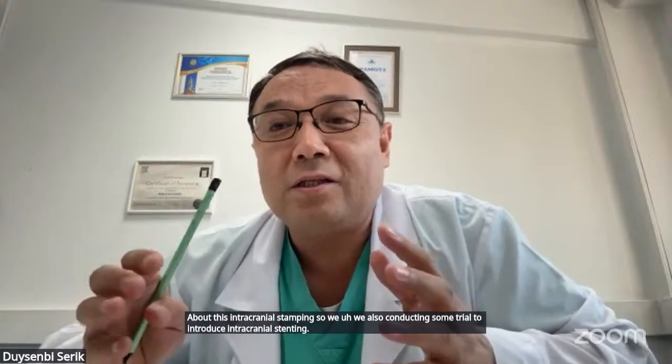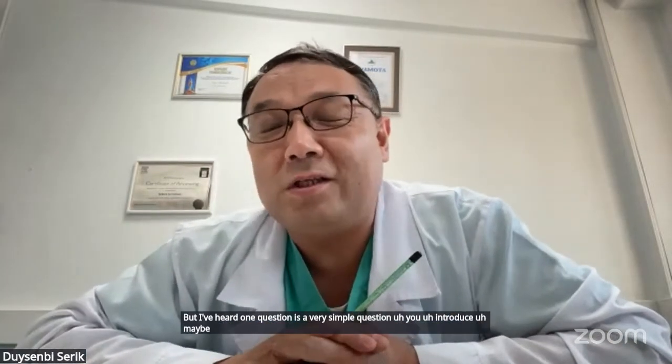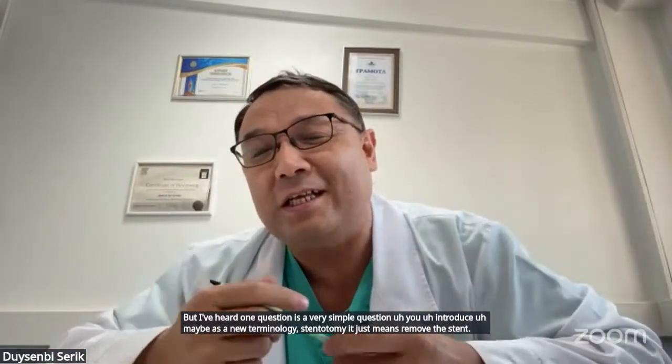But I have one very simple question. You introduced maybe a new terminology, stentotomy. It just means removing the stent using a Solitaire stent, if I understand it.